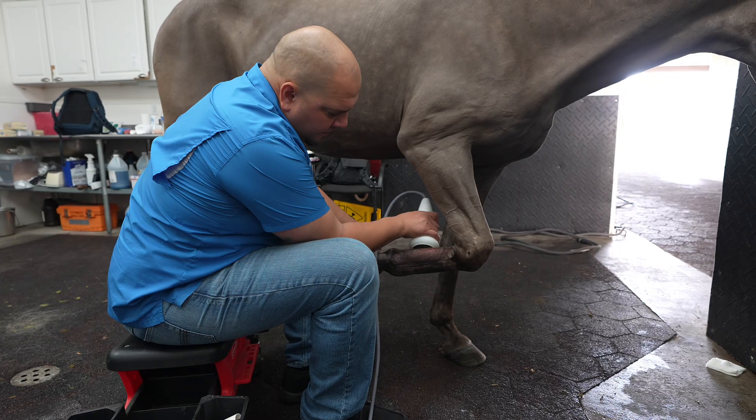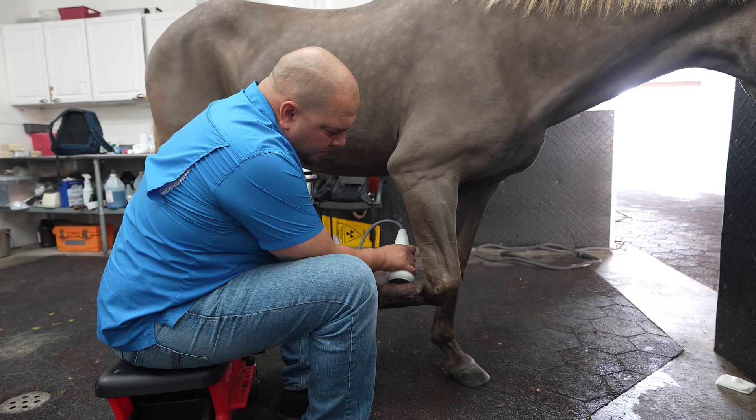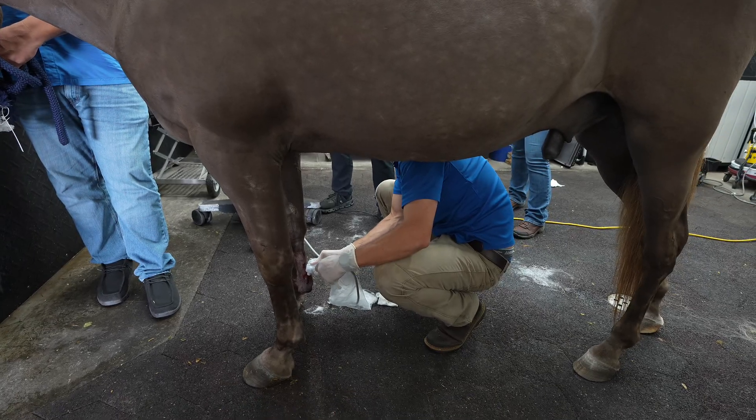As you can hear behind me, we're performing shockwave on a horse. Think of it like a massive sound wave going into the tendons and joints. This increases healing, decreases pain, increases vascularization, and makes the tissue heal faster and better — that's what shockwave does. Now that we have treated this horse, under the direction of Dr. Colton Ramstrom, we've done PRP based on a proper diagnosis of the injured tendon.